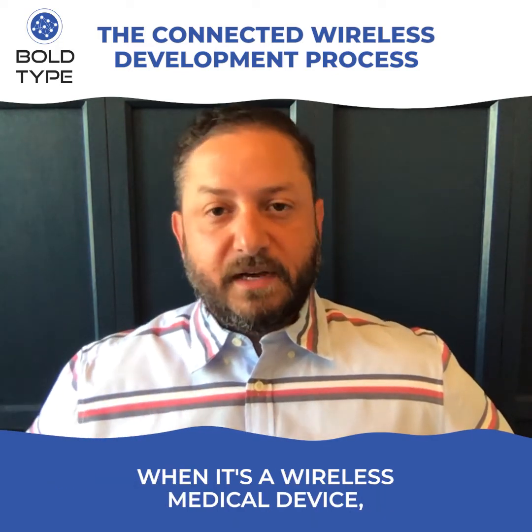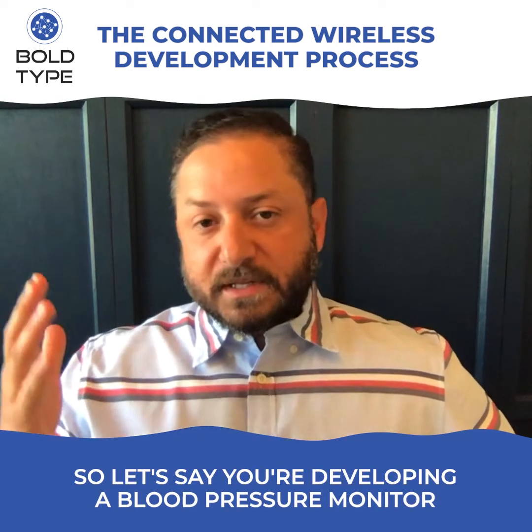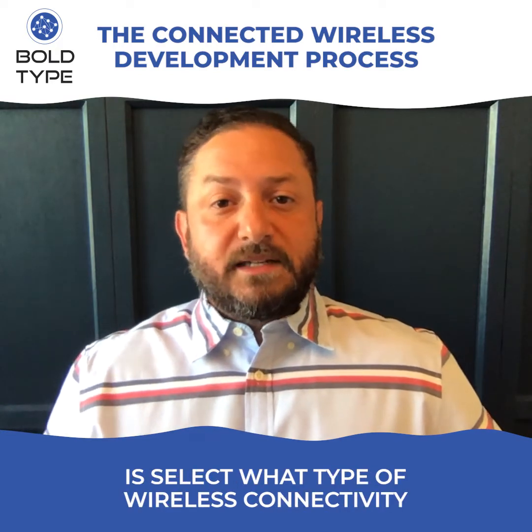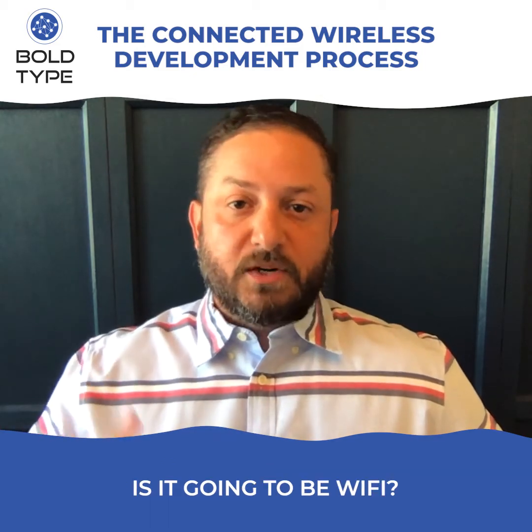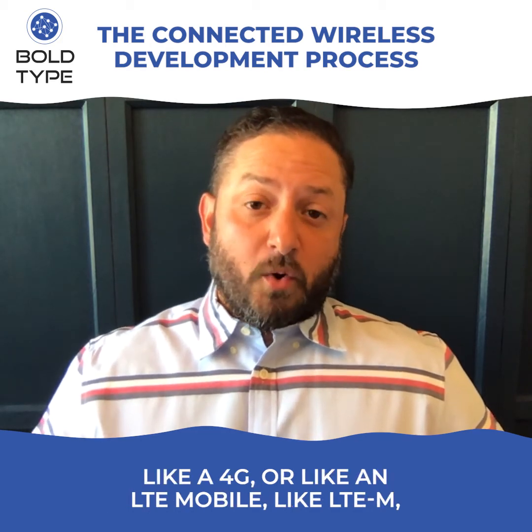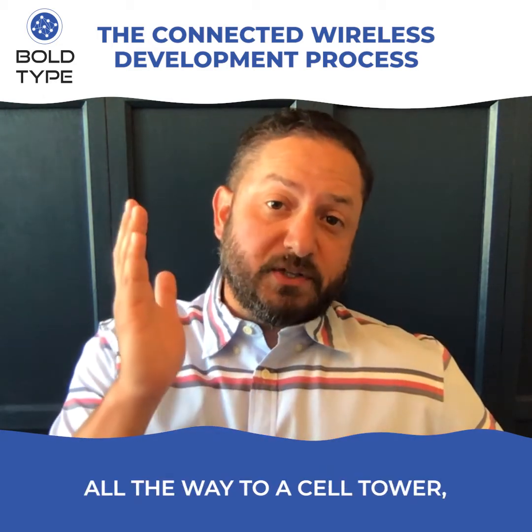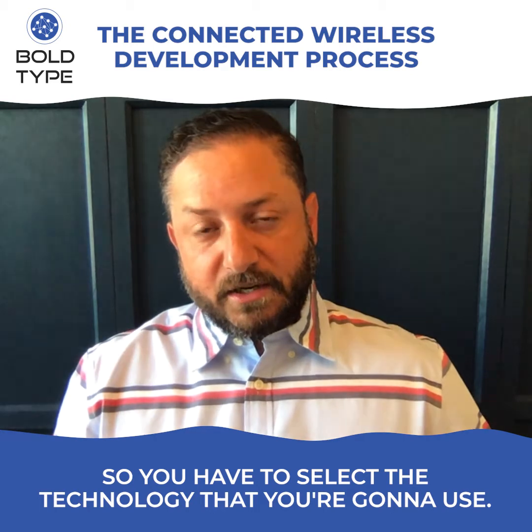When it's a wireless medical device, you have a couple of additional steps that you have to take. The first one is selecting the right architecture. So let's say you're developing a blood pressure monitor that wirelessly connects to a cellular phone, and then that data goes to the cloud. Well, the first thing you have to do is select what type of wireless connectivity you are going to have. Is it going to be Bluetooth low energy? Is it going to be Wi-Fi? Are you going to go directly with a cellular technology like 4G, or like LTE-M, which is a very low power version of cellular, such that the data goes directly from the device all the way to a cell tower and from the cell tower to the cloud? That might be another approach. So you have to select the technology that you're going to use.